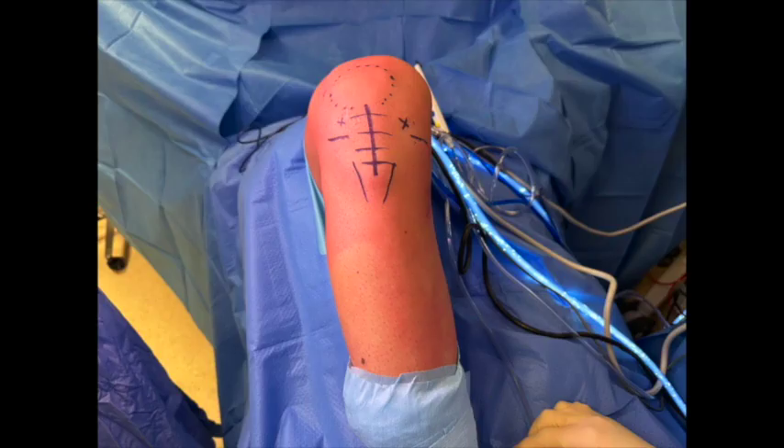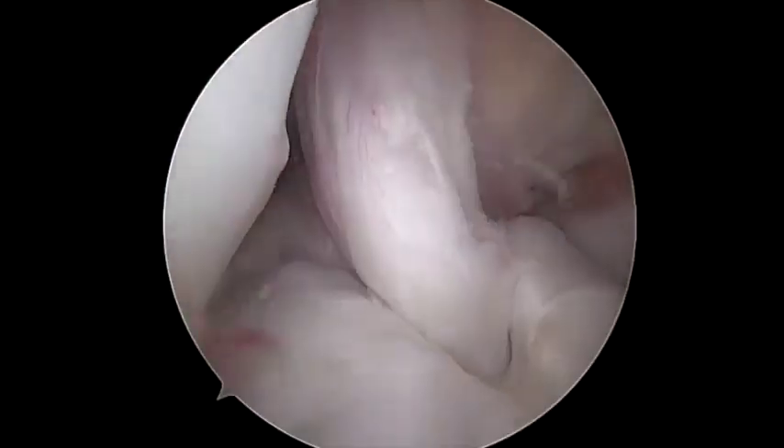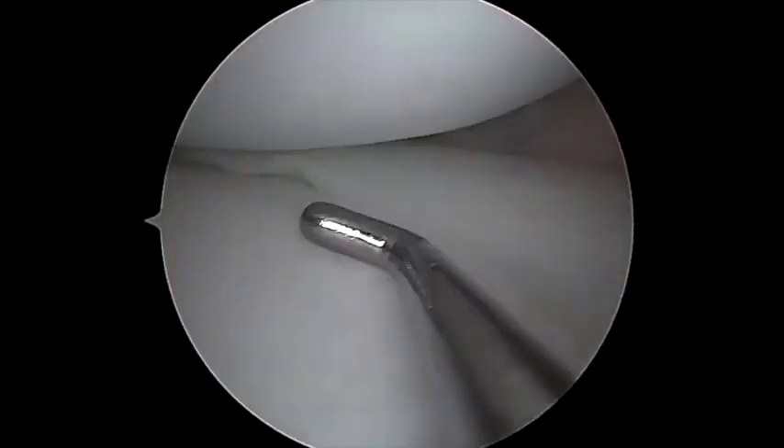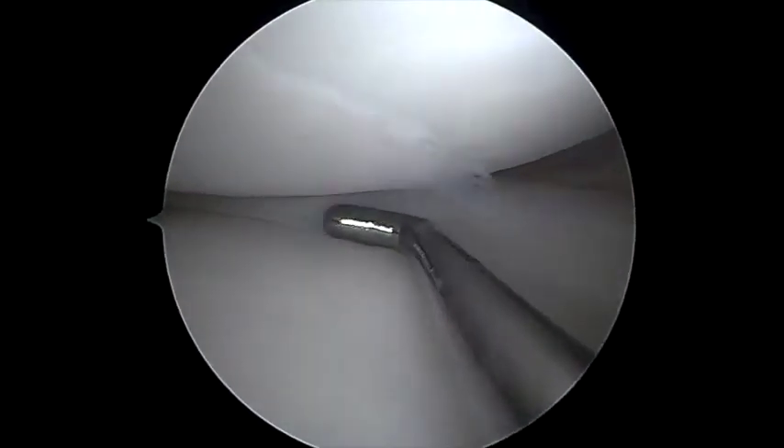We start by harvesting the patellar tendon bone graft. Initial arthroscopic inspection shows a tear of the ACL graft that was removed using a biter and a shaver. No lesions of the medial meniscus were observed.